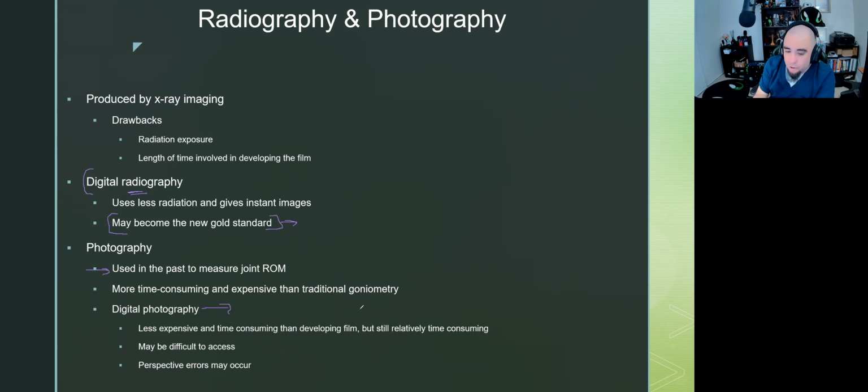I've had a couple of surgeons that really like that method because 0 to 130 may not mean anything to them, well, it should, but it may not mean anything when they're just looking at it. But if they can actually see what that 130 looks like, it can help guide their plan of care as well.